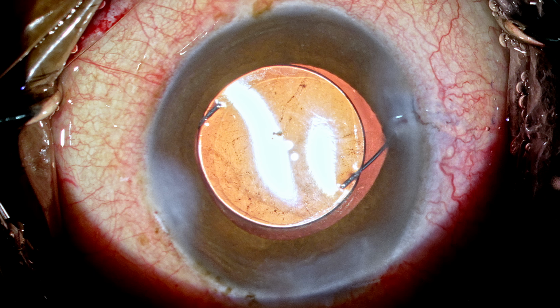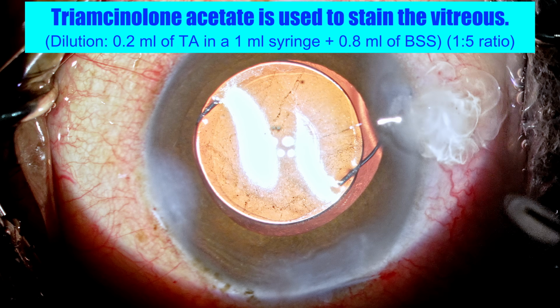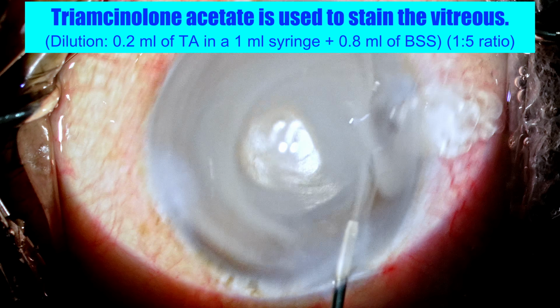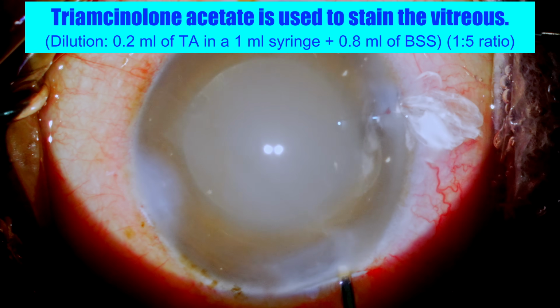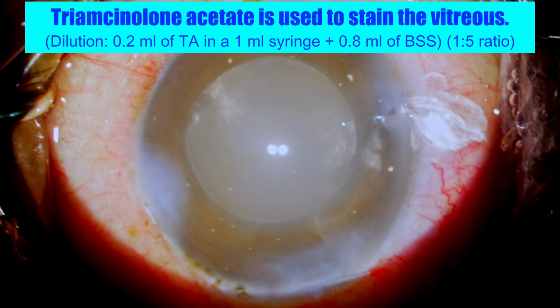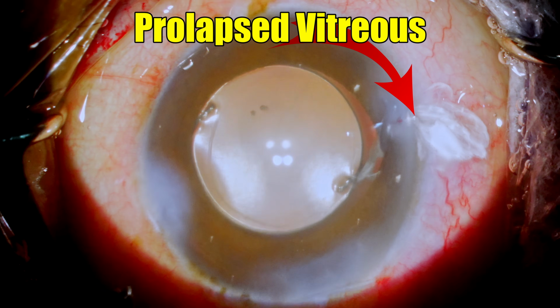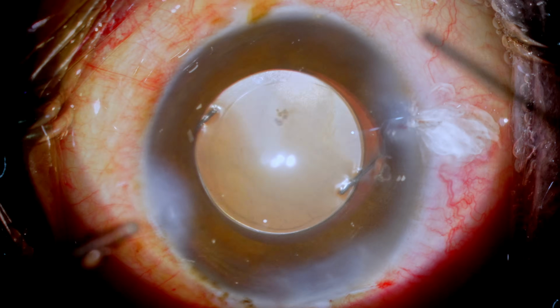The first thing I do is inject diluted triamcinolone acetate. The dilution is created by taking about 0.2 ml of triamcinolone acetate in a 1 ml syringe and adding BSS to make it 1 ml. So it would give a concentration of 1:5. And the moment triamcinolone acetate is injected, we can see the vitreous which has prolapsed out through the wound very clearly visible.